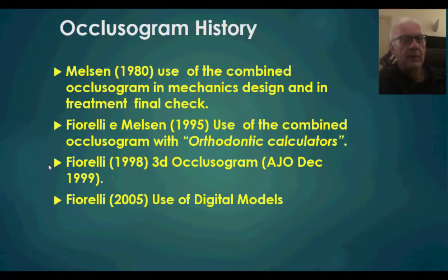In 2005, things started to change because we had available the digital models, and I started using the digital models at that time. This made a lot of changes for the speed of the procedures and the quality of the occlusogram, but moreover, it gave me the possibility to develop the occlusogram further and to go to the next step.